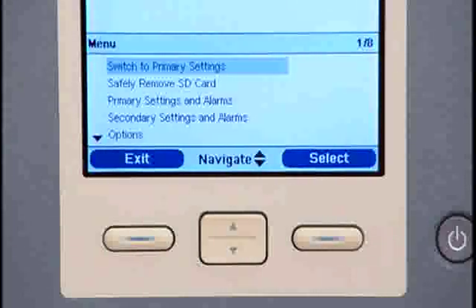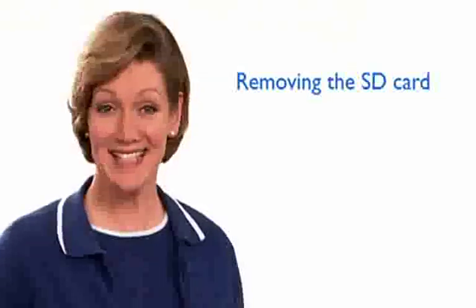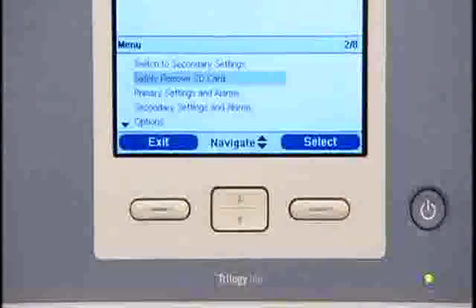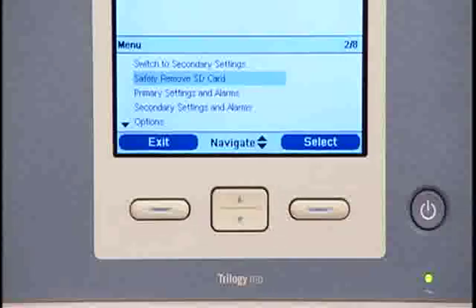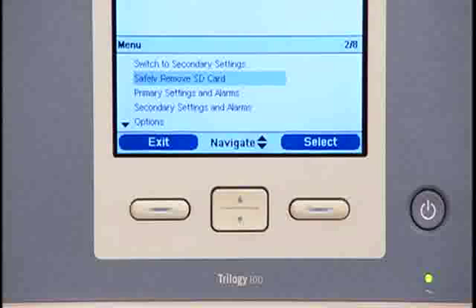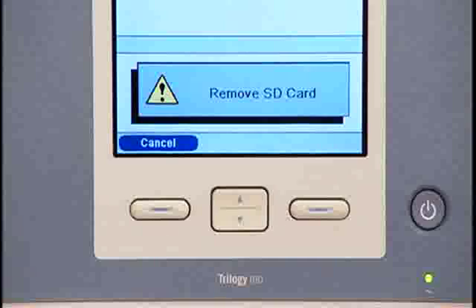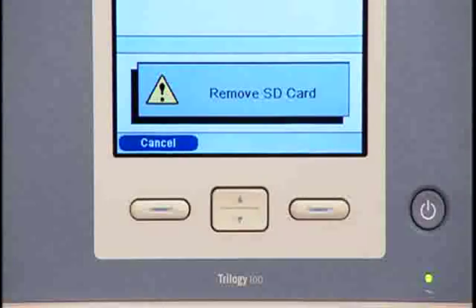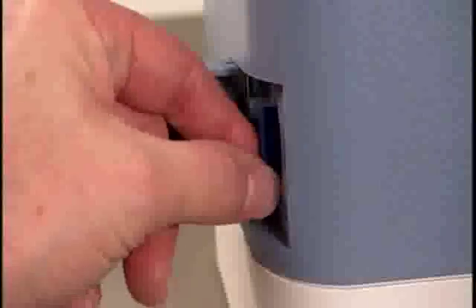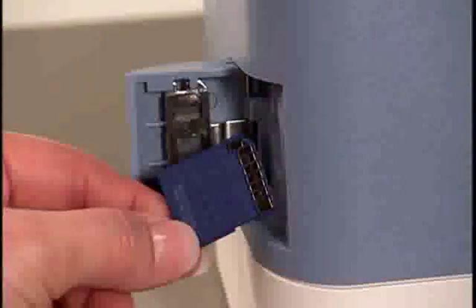The display screen returns to the main menu after a selection is entered. If there is an SD card in your ventilator, 'safely remove SD card' will appear as a menu option. Select this option when you want to remove the SD card. When the Remove SD card confirmation message appears, remove the card. If you press the left button or don't remove the card within 60 seconds, the confirmation message will close and Trilogy will continue to write data to the card.